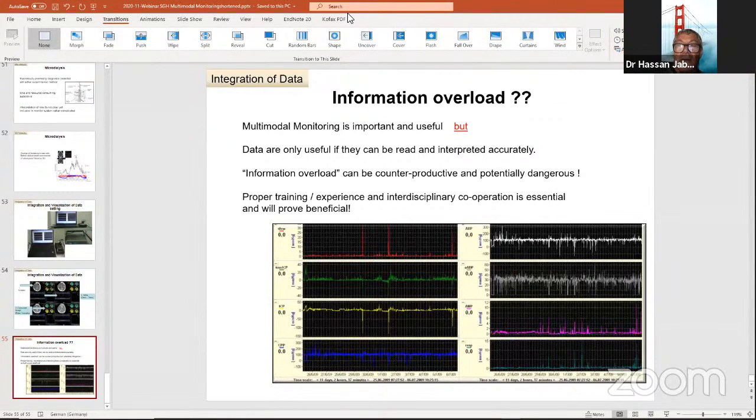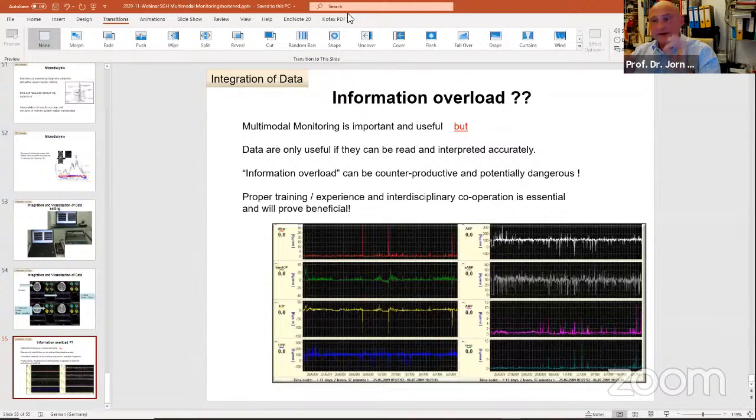I have sent patients, and they love me for it, to the neuroradiologist for intervention with nimodipine vasodilatation, three times over the course of the term, because it was very sensitive and the PO2 went down. Then they took him to the angiogram, opened the vessel, and it went up again. After a day or two it went down again, then up again. Then that acute phase was over, and the patient recovered. Okay, so there is a benefit.